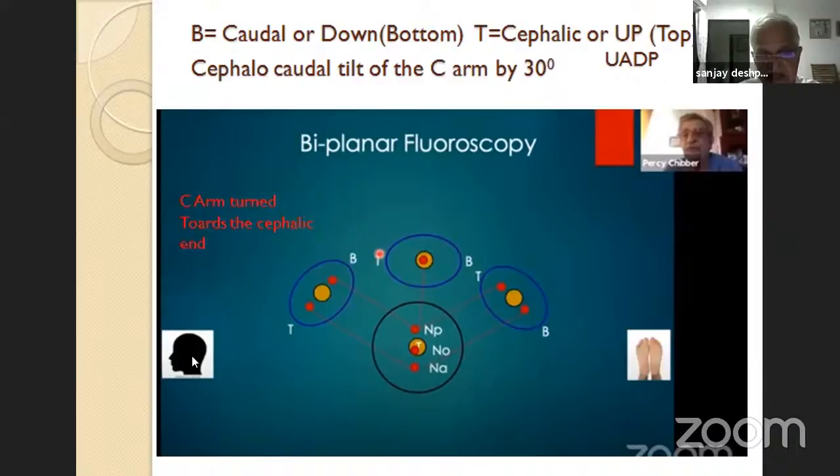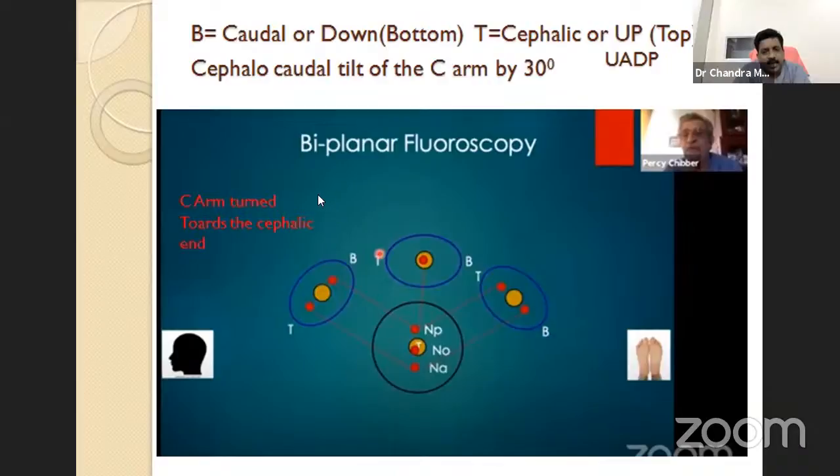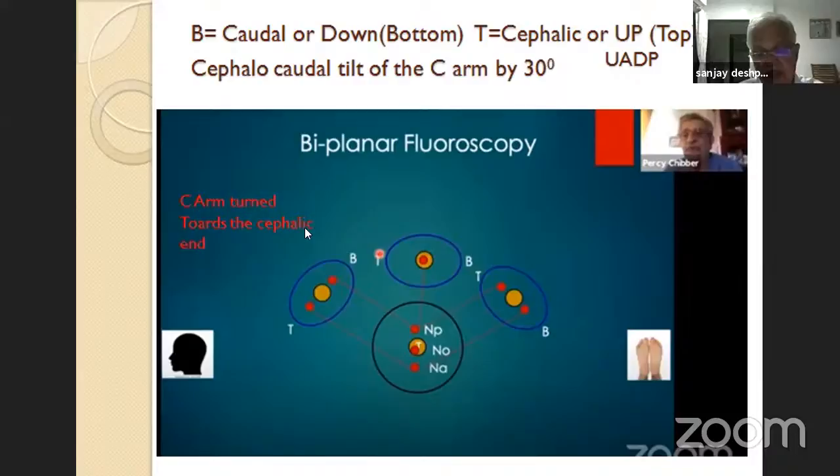Head end, correct. That means if your needle is anterior, you are more towards the head end side. You have to come down. No, no. See, if your needle is anterior, that means what will happen? Your needle is above the calyx. So what Jaitip Datta used to say, you withdraw and again go back in the direction in which you saw your needle before. You got my point. That means you have to come superficially.